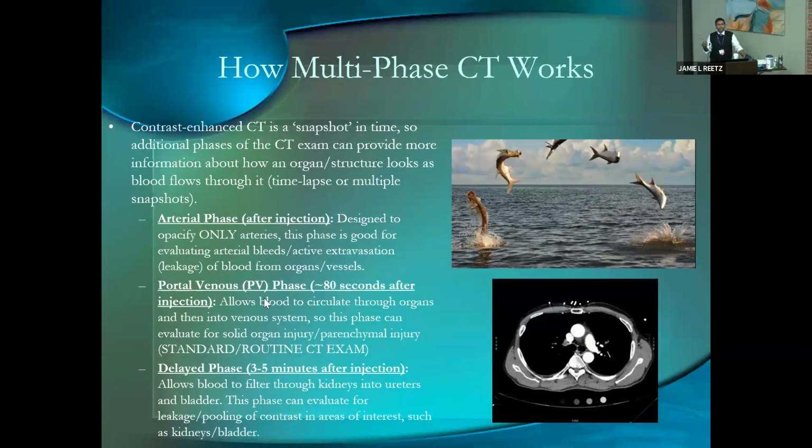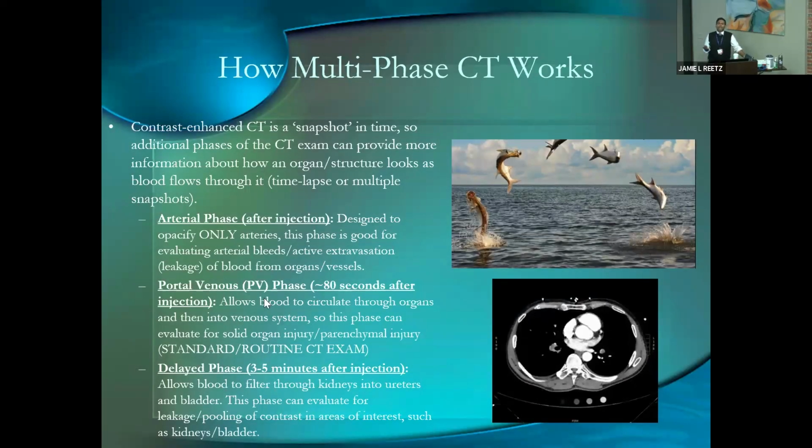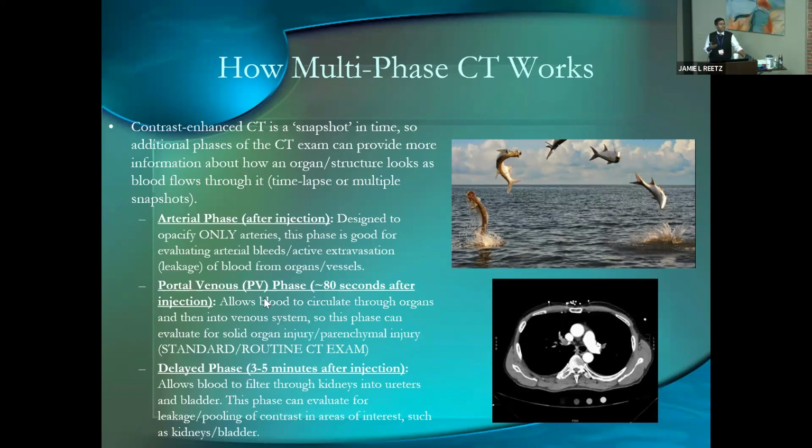And again, this is something that some of you are probably aware of, which is multiphasic CT. In 2013 when I started, it used to be a huge deal when we did these. Now it's old hat. You just tell them you're doing a multiphasic CT, and they'll do it.